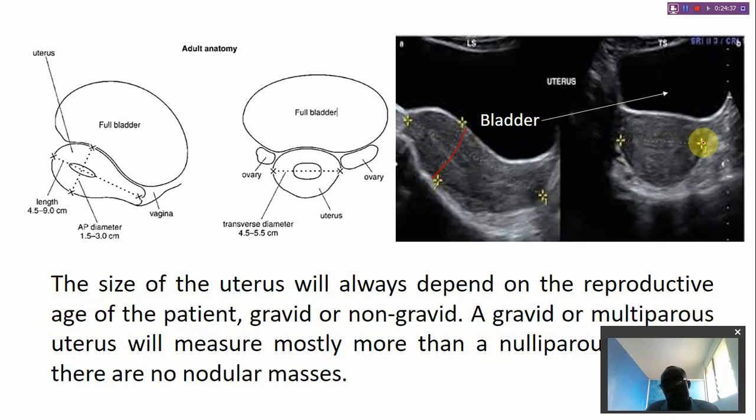And the transverse view, so you measure the width. From here is the anterior posterior dimension, the length of it, to give you the volume. So assuming this is the size of the uterus we're talking about, remember that it says 9 by 3 by 5.5. You put all this into a calculator, and you find the volume of it.